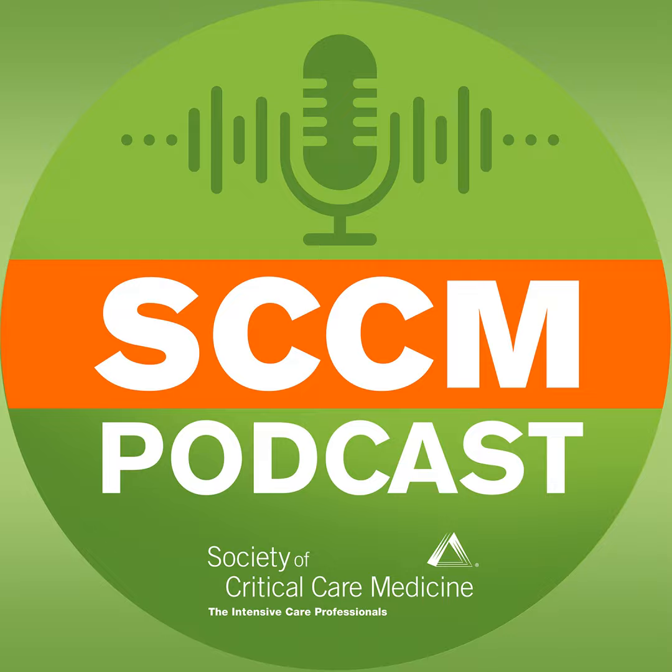Thanks for that. So it sounds like the optimal conditions would be, obviously suboptimal, but a situation in which you don't have enough ventilators, but have adequate staffing and monitoring to be able to serve as that additional layer for these patients. I think that's a great summary. That's absolutely correct. Gotcha. This is not a panacea. This is not, put the two patients, set up the circuits, put the two patients and walk away. That's absolutely not how to use this.